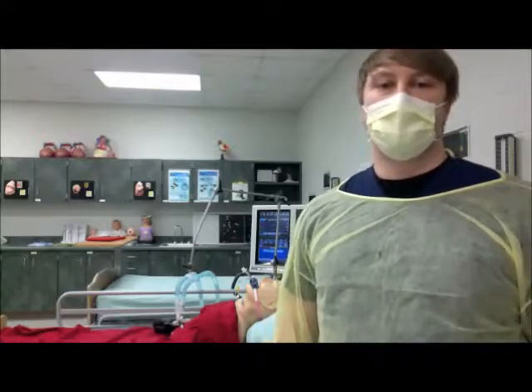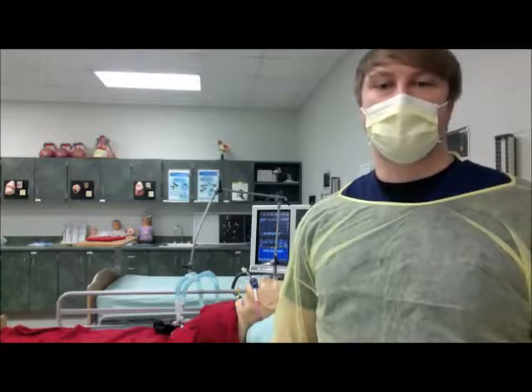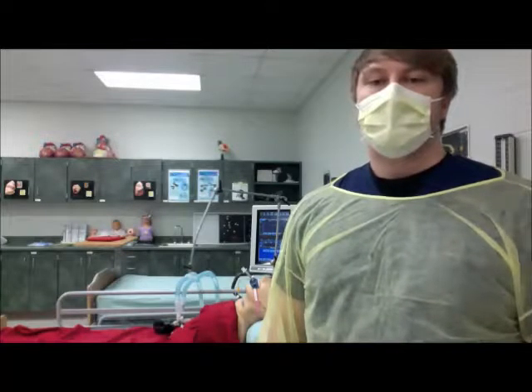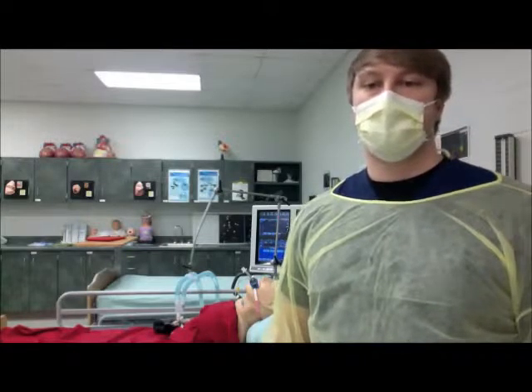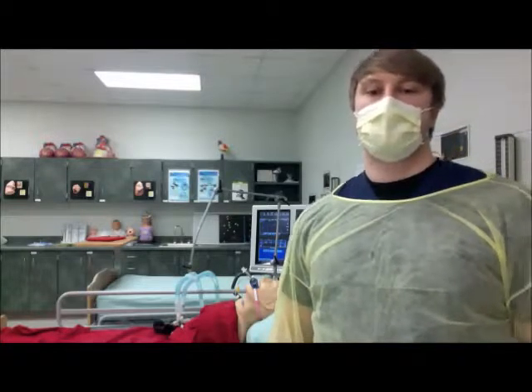Fifth thing is a NIF, negative inspiratory force. We do these to test the muscle strength to see if the patient, Mrs. Tubbs, can protect her airway off the vent by coughing. The normal should be less than or equal to negative 20 centimeters of water pressure. Anything more, that's great. The last thing we want to look at is non-invasive oxygenation.